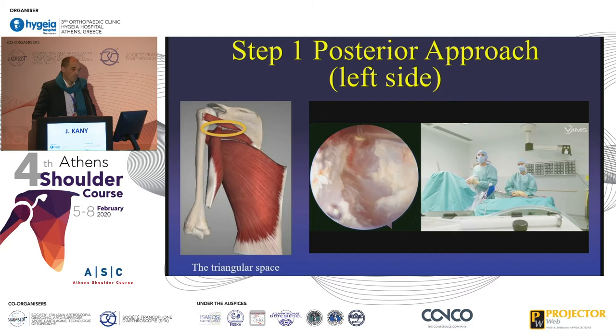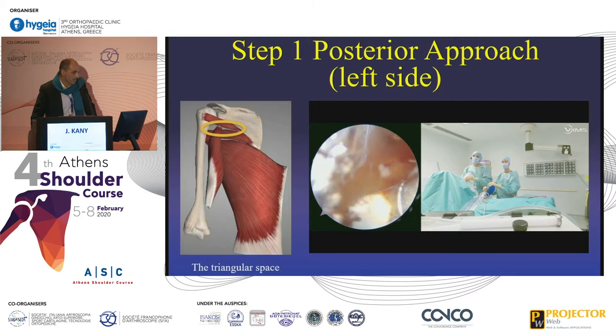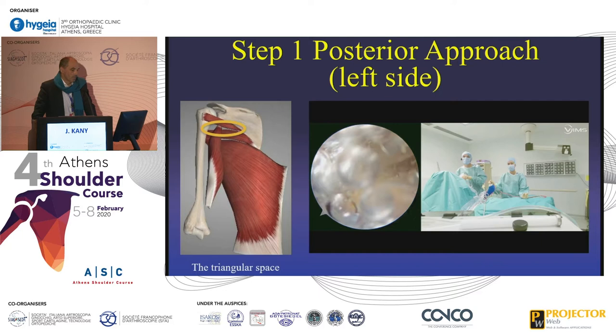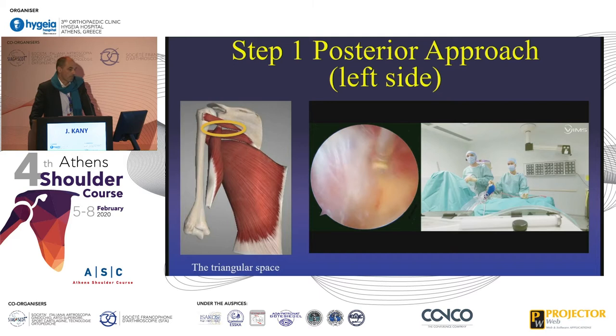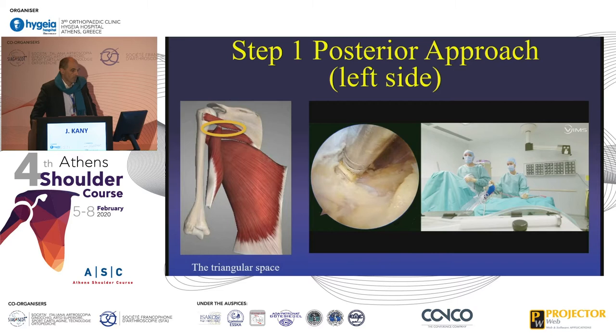We have the teres major and the lat dorsi just under. So now we are on the left shoulder, and you can see on the right there is the deltoid, and on the left this is the teres minor. You go through, you open the aponeurosis, and then you will find a muscle. Which muscle is this? Sometimes it's difficult to tell — it's either the lat dorsi or the teres major — but the goal is to find the vertical fibers of the long head of the triceps. This is the key to success of this dissection.